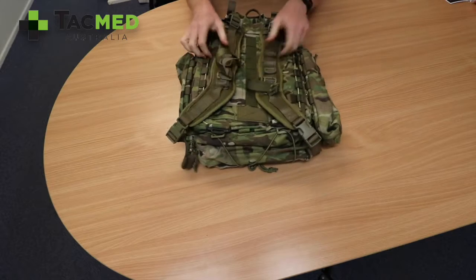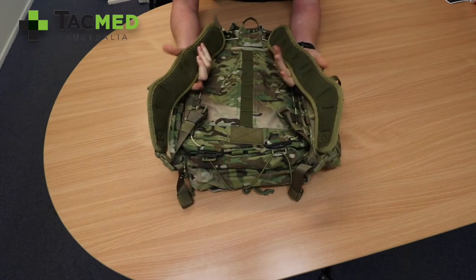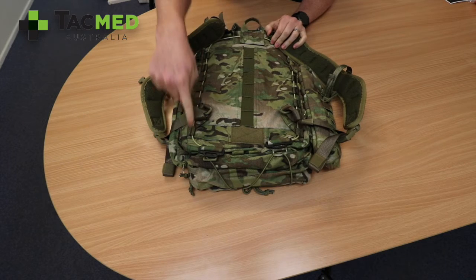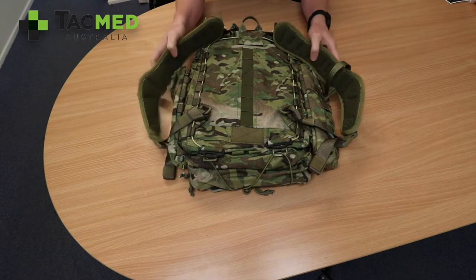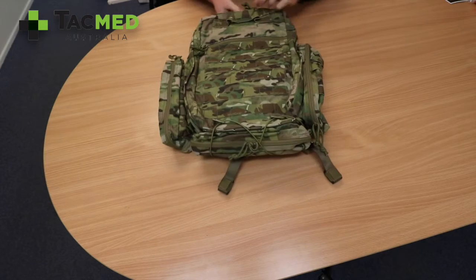On the back, TAK Med supplies it with removable, comfortable straps. If it's going to be used in a tactical sense, it can be attached to the back of body armour, and it has a quick-release system — you pull it and it will drop off the back. So let's open it up.